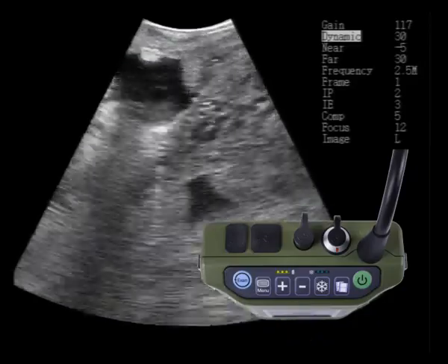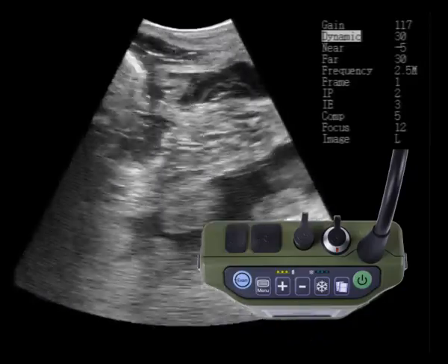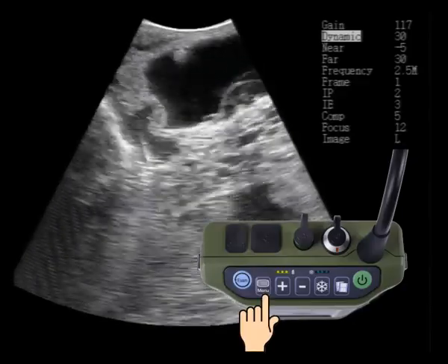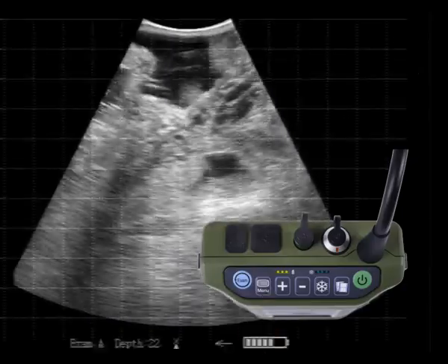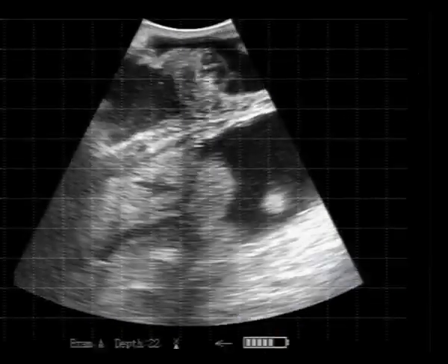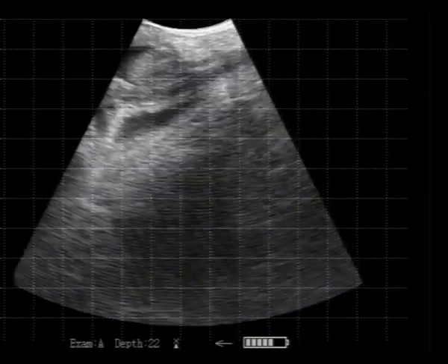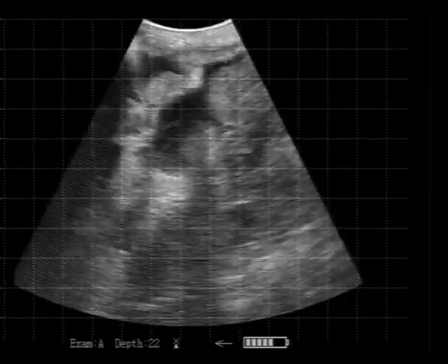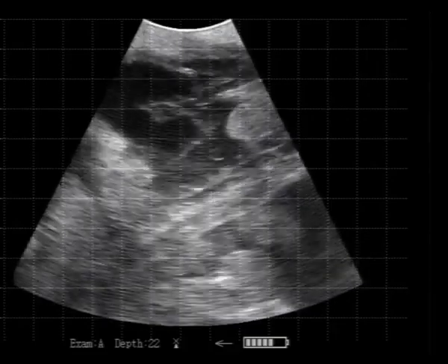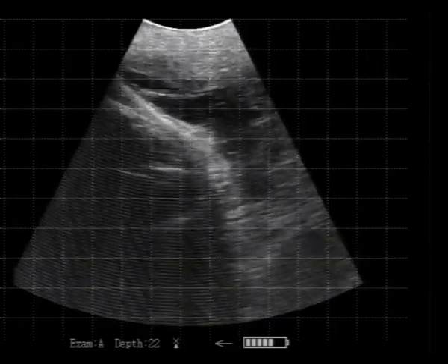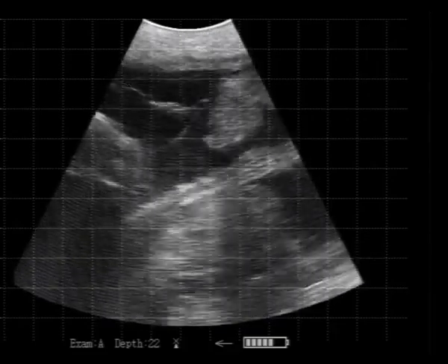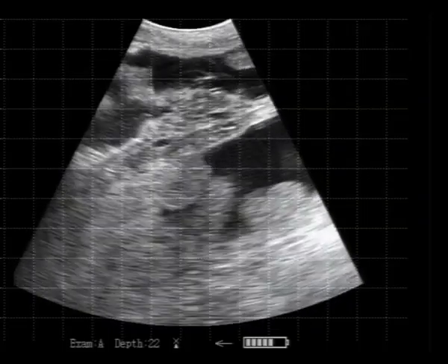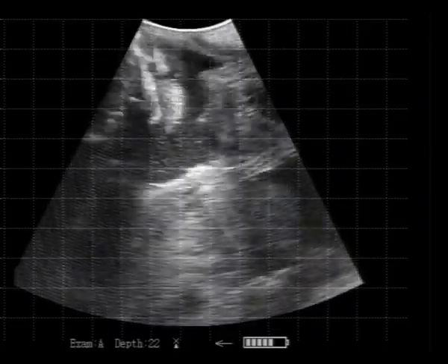This is the image that we started with initially — the cotyledons are now very distinct. We press the menu button twice and we're back out into active scanning mode. With a 2 centimeter grid, we can see those cotyledons quite clearly. We see the calf's head and some membranes. A very useful image for pregnancies.